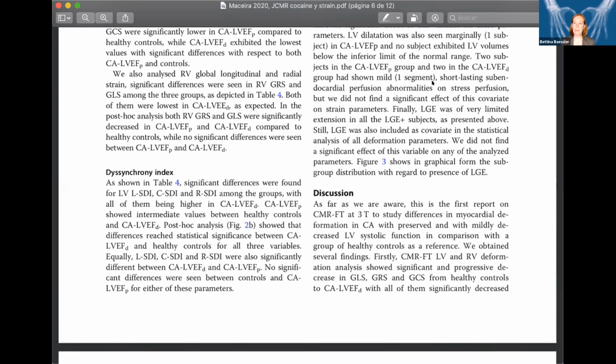Okay, thank you. Matthias, you have a question. Do you want to unmute yourself? Sure. Yeah, thank you very much, Alicia. So my question is, there is a method called long axis strain, where you just look at the shortening of the long axis between mitral valve and apex as a surrogate for the global longitudinal strain. Since this is much easier, and there are some papers even showing a prognostic impact, what is your take on that, comparing this method with the global longitudinal strain as measured through the methods that you used?